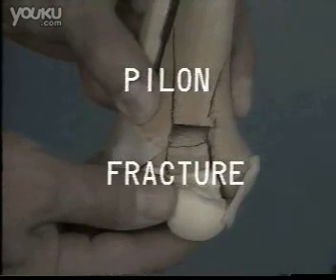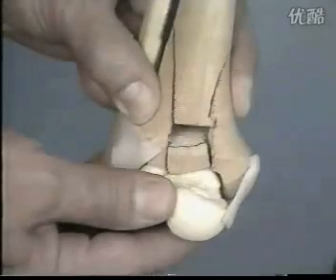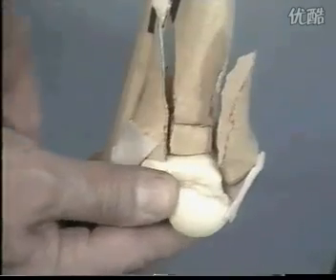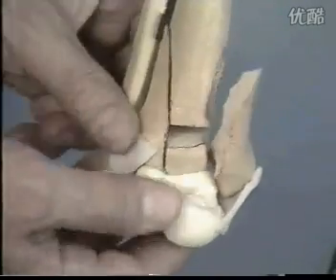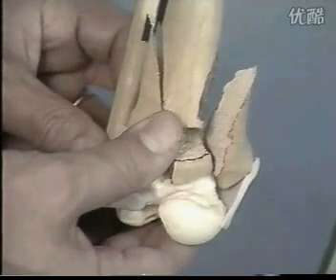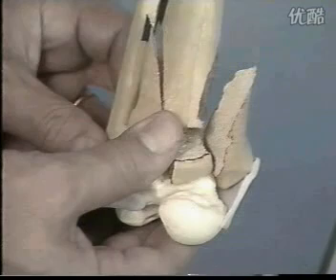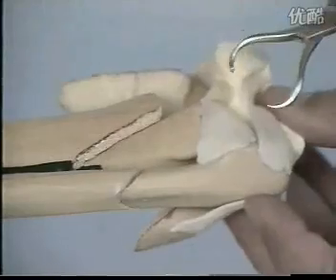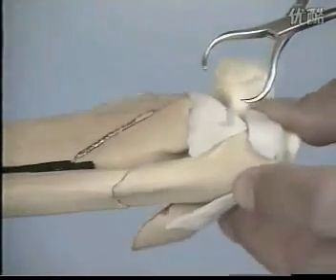Pilon fracture. This model of a distal tibial joint fracture, also a so-called pilon fracture, involves the talus and the ligaments. It shows the comminution of the distal tibia with impaction of a central joint fragment, which, after reduction, shows a large metaphyseal bone defect.